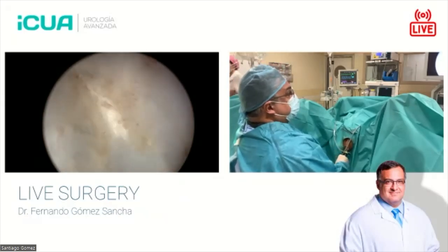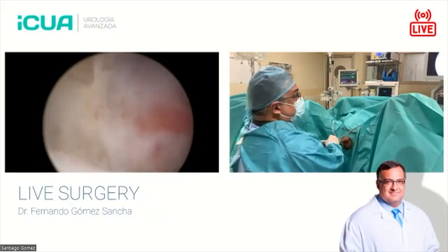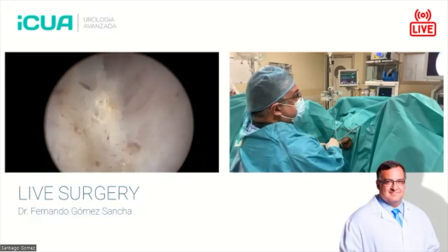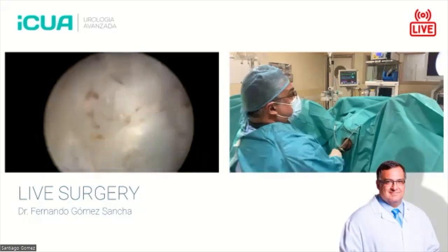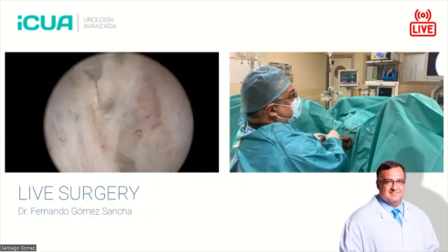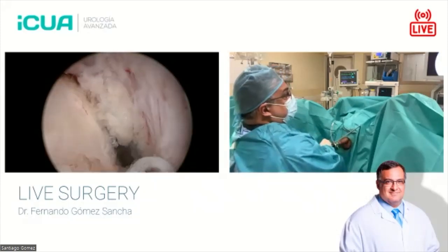And when you do this with very long lines, like I do, I go up and down. I don't do pits, I don't do holes. I just try to keep a very wide line of dissection. It's quite easy to understand what's going on. It's quite easy to judge what we are doing. You get good orientation.